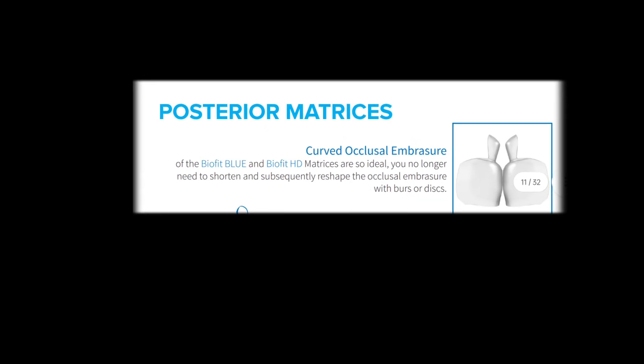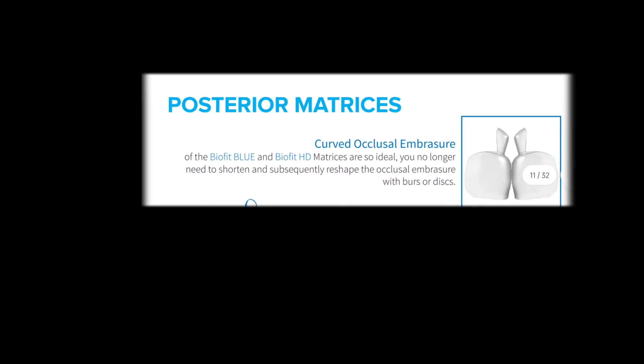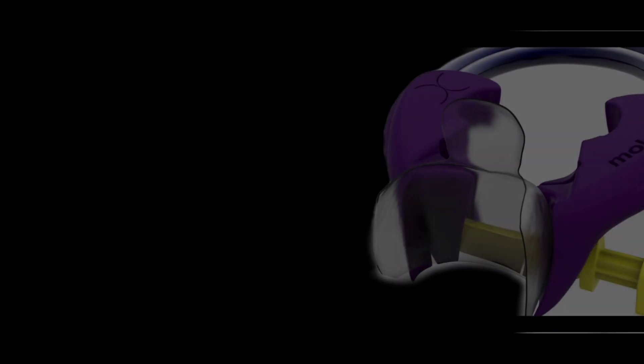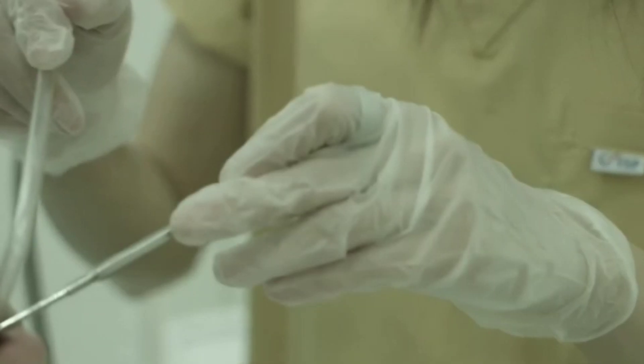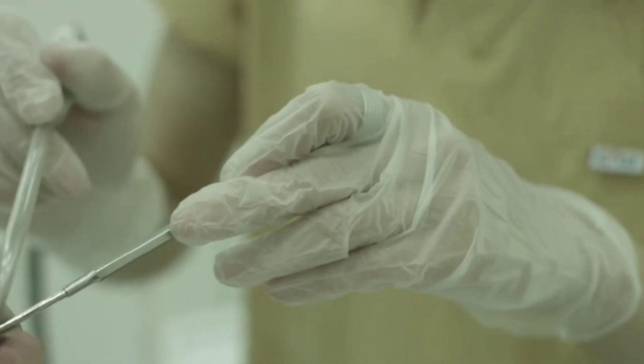The manufacturer also claims that the curved occlusal embrasures of BioFit HD matrices are so ideal that you no longer need to shorten and subsequently reshape the occlusal embrasures with burs or disks.